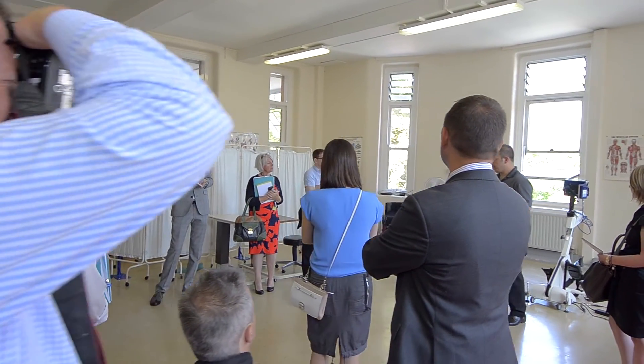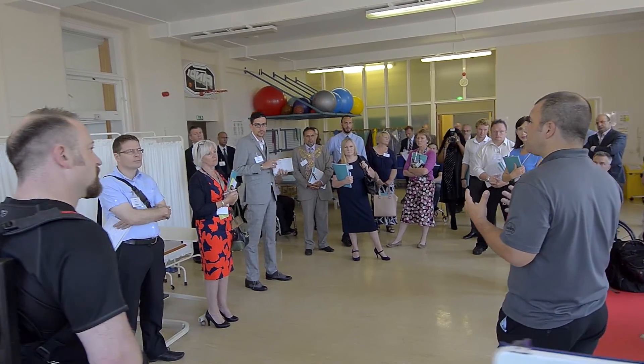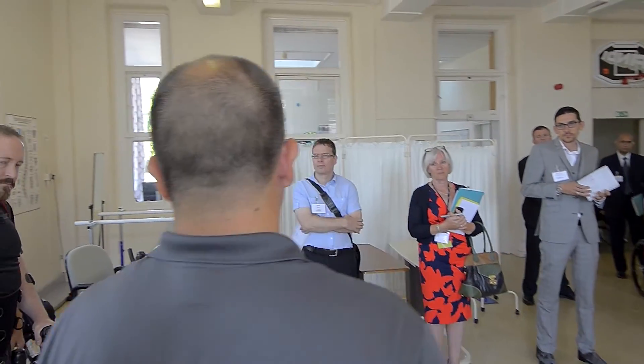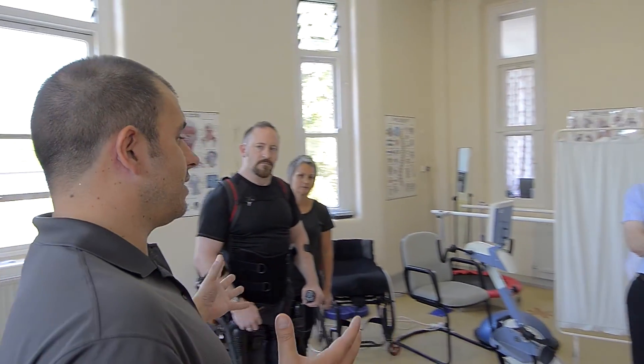I've seen clients have issues with a health and wellbeing approach — to look after themselves a little more — with the Oxford aimers to be able to start to train and start to think about the technology here.